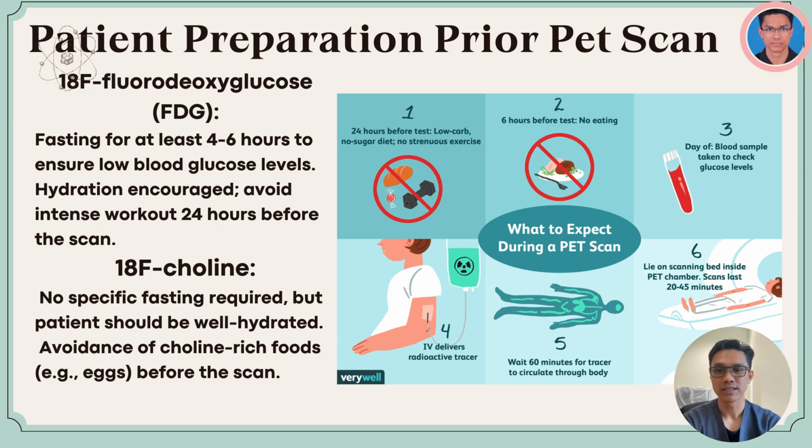After the scans, patients are encouraged to drink plenty of fluids to help flush the radiotracer from the system. We also advise patients to avoid close contact with pregnant women and young children for a few hours after the scan due to residual radioactivity.